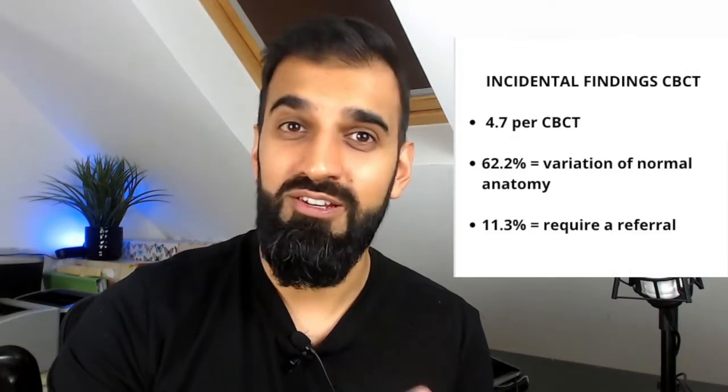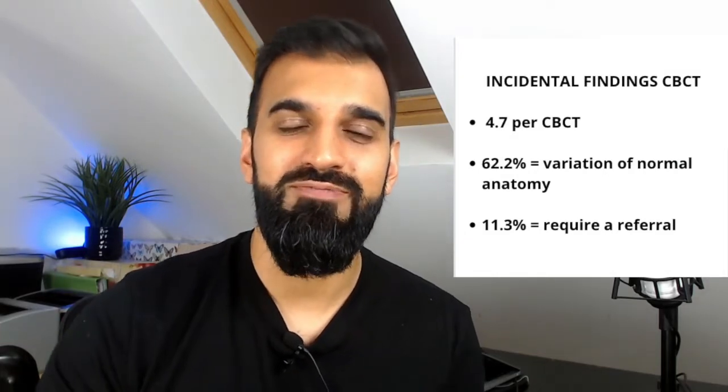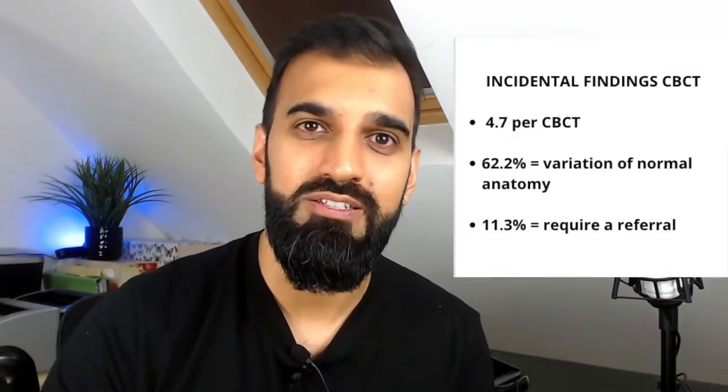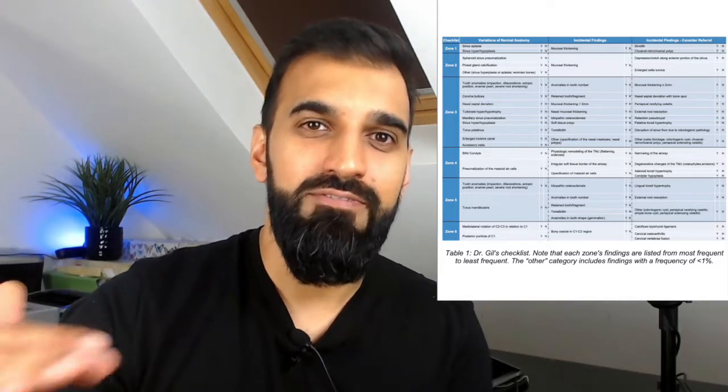Fortunately, the majority of the findings from his study showed that there were variations of normal anatomy, around 62%, and only 11% required onwards referral. He produced this fantastic checklist, which I do hope he gets to publish. But giving some examples, variations of normal anatomy included dilacerations, nasal septal deviations. Now, incidental findings that didn't need any onwards referral were things like retained teeth, mucosal thickening, and idiopathic osteosclerosis. Now the 11%, the incidental findings that required referral onwards, were things like external resorption and odontogenic pathology.